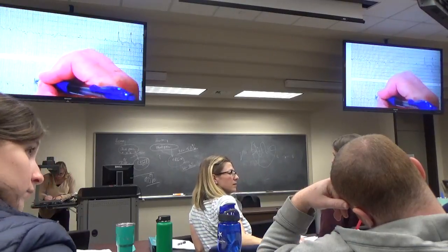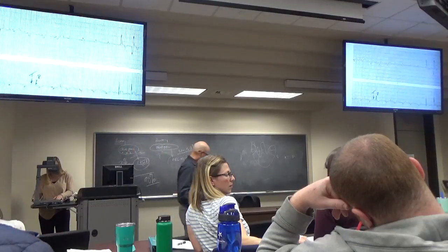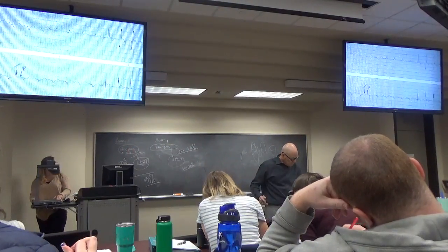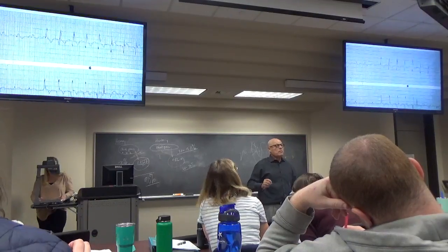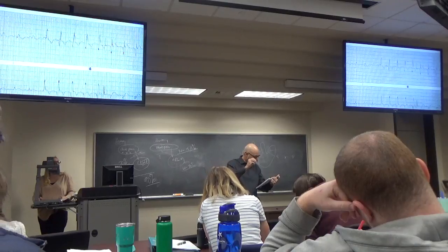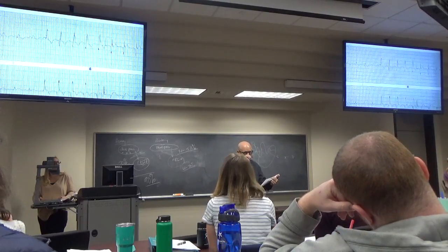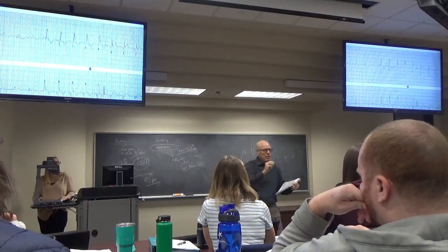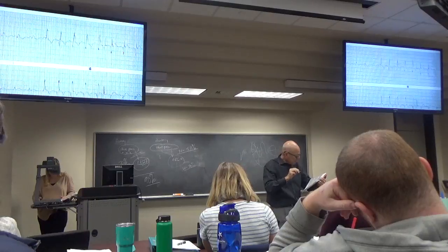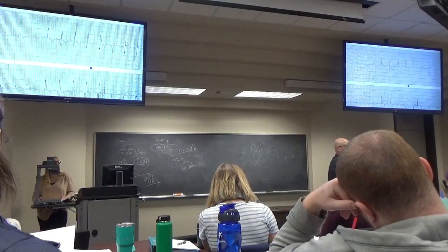I also got the left atrial enlargement because of the inverted P wave. Well, the P wave is not inverted in V1. The P wave is initially up. For some of them, it might be down a little bit. It might be a little bit biphasic. But the P wave goes up first. Then maybe down a little bit, but it's mostly a normal P wave. Other questions?